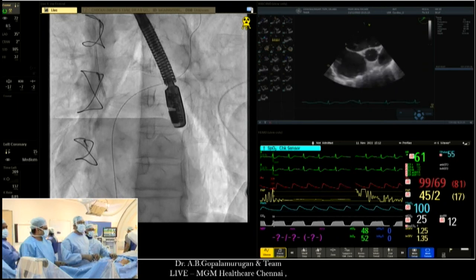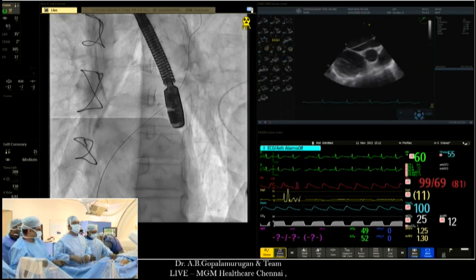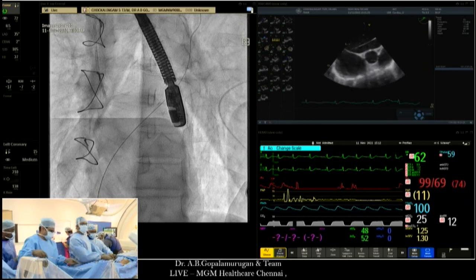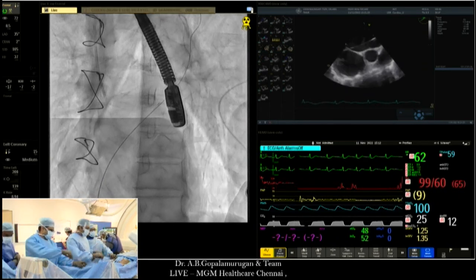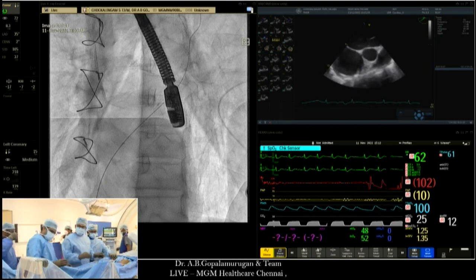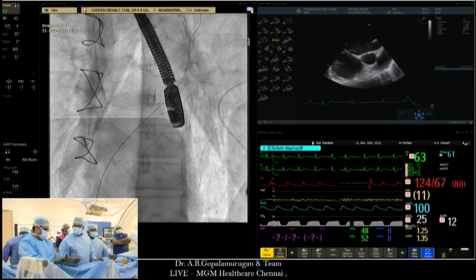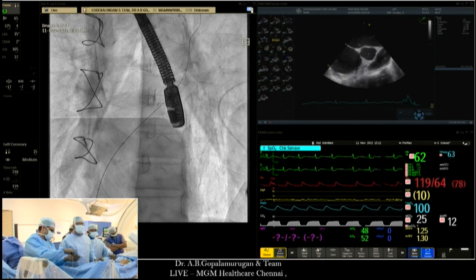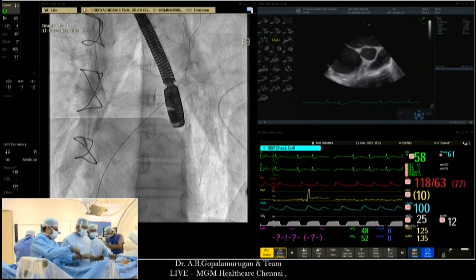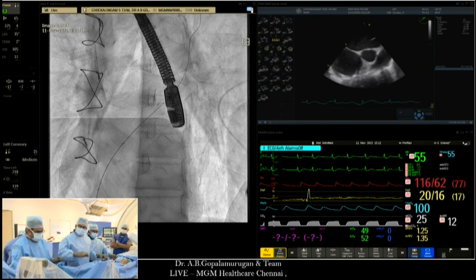Let me ask Rahul. Dr. Rahul, what will be your strategy for a septal puncture and septal dilatation to facilitate your device for TMVR? So as I think he has pointed out, getting a good septal puncture is extremely important. Like he took all the time where the LA is dilated, getting posterior inferior. Once we are in, for septal dilatation, I would use about an 8 millimeter balloon. Don't you think 8 will be a little too small for 14?